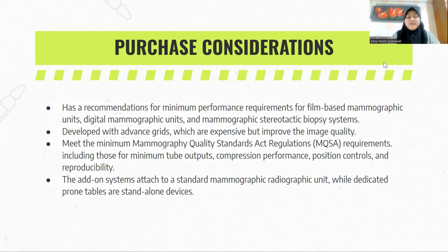And then developed by advanced grids, which are expensive but improve the image quality and meet the minimum MQSA requirements, including those for minimum tube output, compression performance, position controls, and reproducibility. And the last is the add-on systems attached to a standard mammographic radiographic unit, while dedicated prone tables are standalone devices.